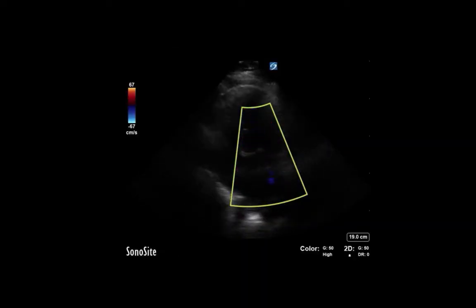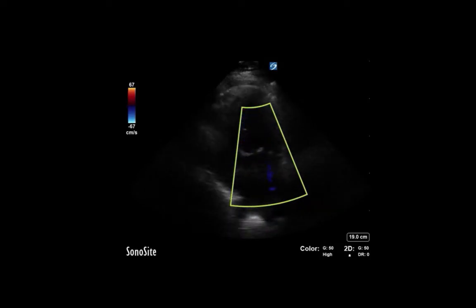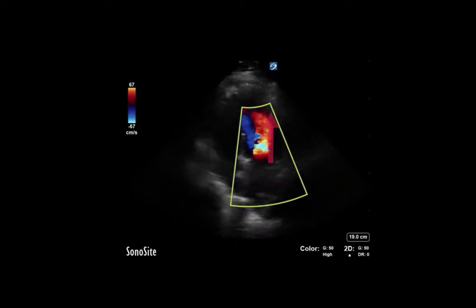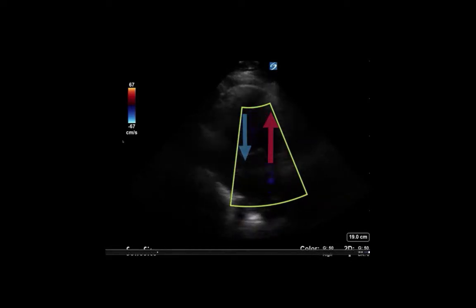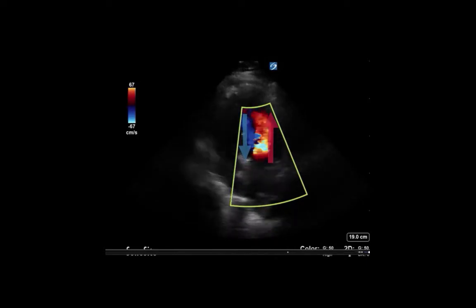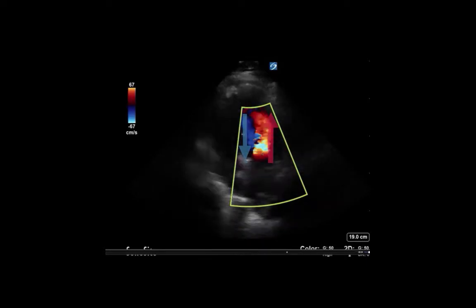So this is a typical color Doppler screen of an apical 4-chamber of fairly marginal 2D quality, but the color information seems actually pretty good. And you can see that the mitral inflow to the left ventricle, of course, is towards the transducer, and so it is portrayed as red, and the outflow during systole is blue, in keeping with our color map here. Our color map also shows us the Nyquist limit, which is the speed beyond which we will see aliasing.